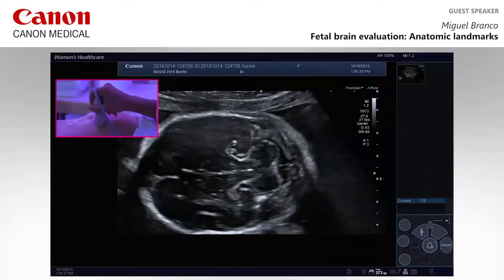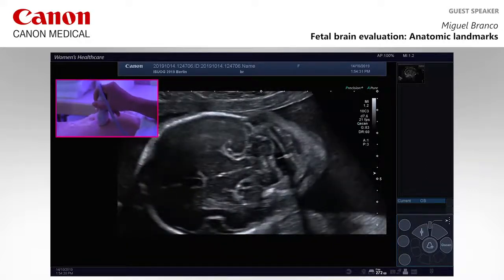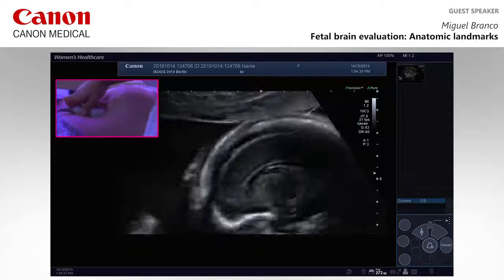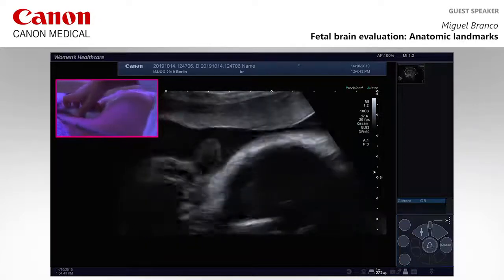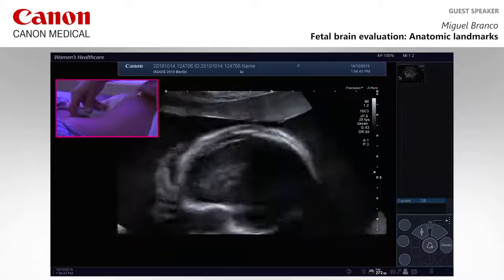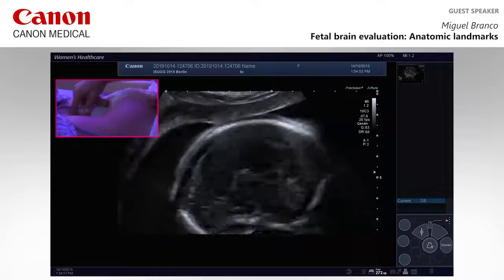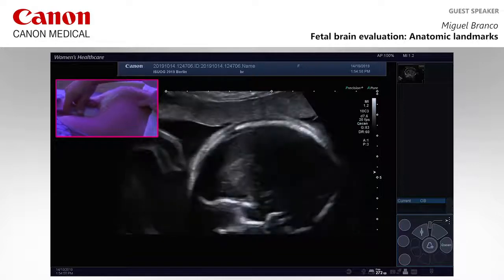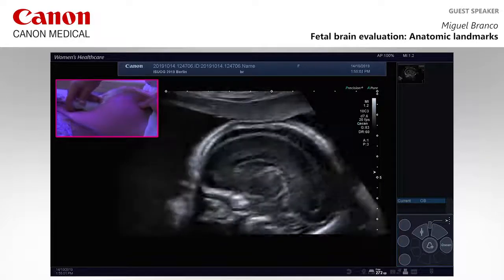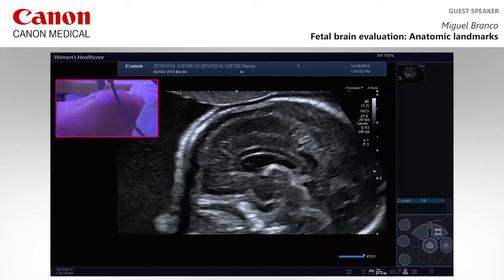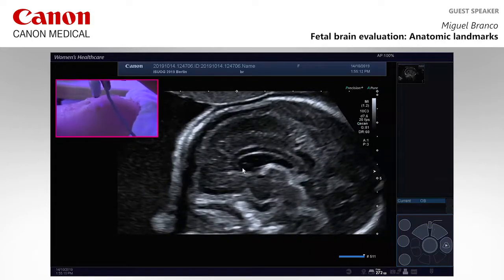Now we go to the sagittal evaluation. I'm really on the top of the uterus — it's not an ideal position. Here we are able to see the rostrum of the corpus callosum and the tela choroidea.